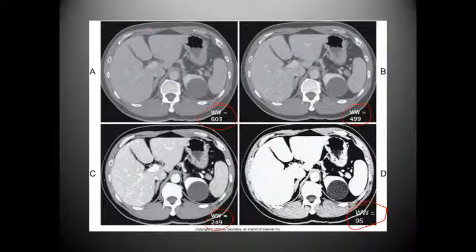And so, as we can see, there's tons of gray, only black in a portion of the stomach, but everything else is kind of grayed out. If you ask me, there's not a huge difference between image A and image B because we still do have a lot of gray. And honestly, for me, the book says that 499 is the most applicable thing to visualize abdominal structures, but I kind of favor that you need around the area of 350 to 450, being that you represent less gray, and so it would make the vascular structures kind of stand out a little more.